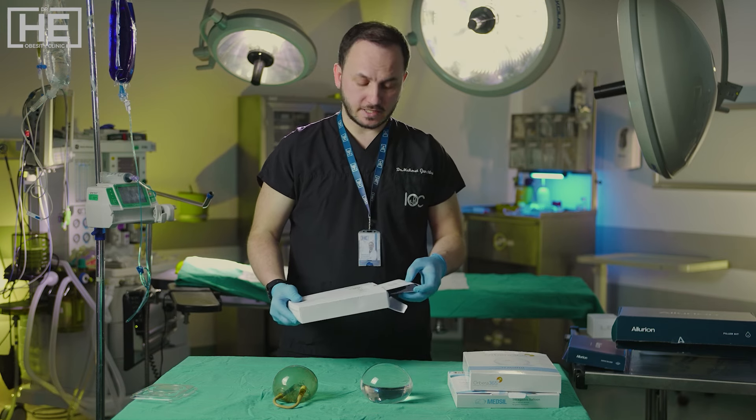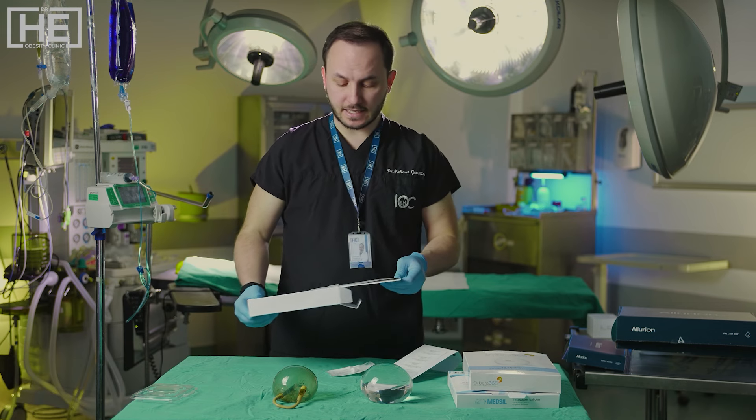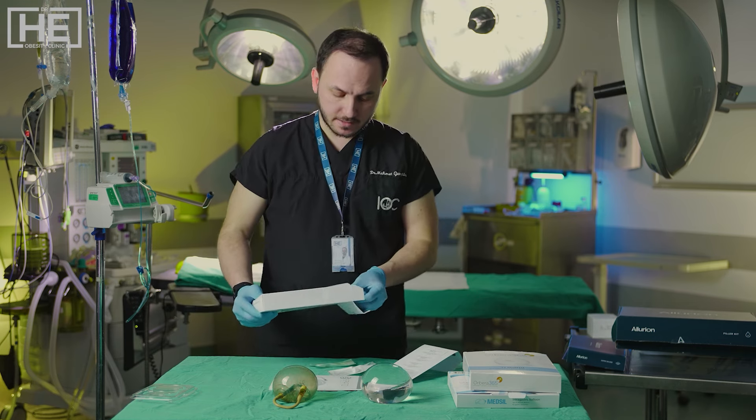Let's continue with the Spatz-3 adjustable balloon. This balloon is unique. What makes it unique? It is a fully adjustable balloon. Let me show the details.